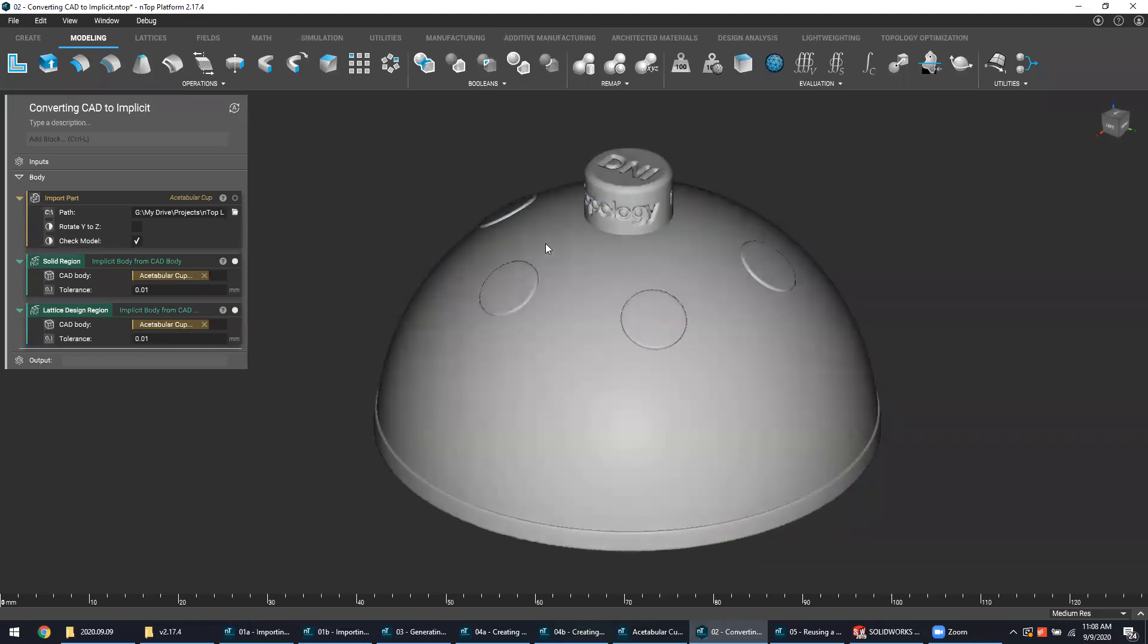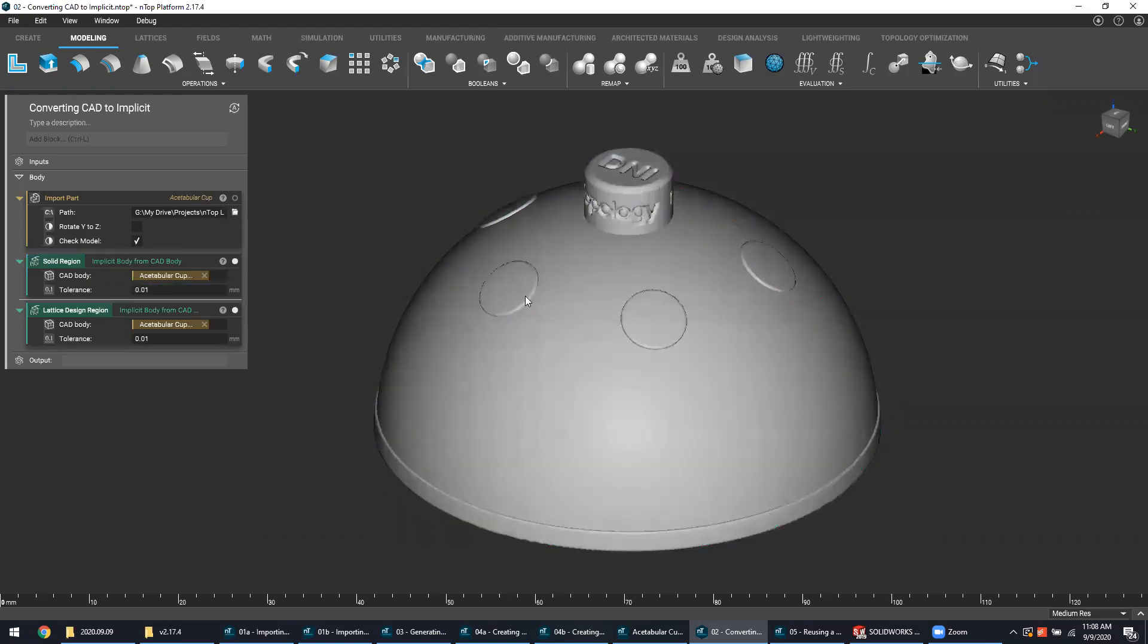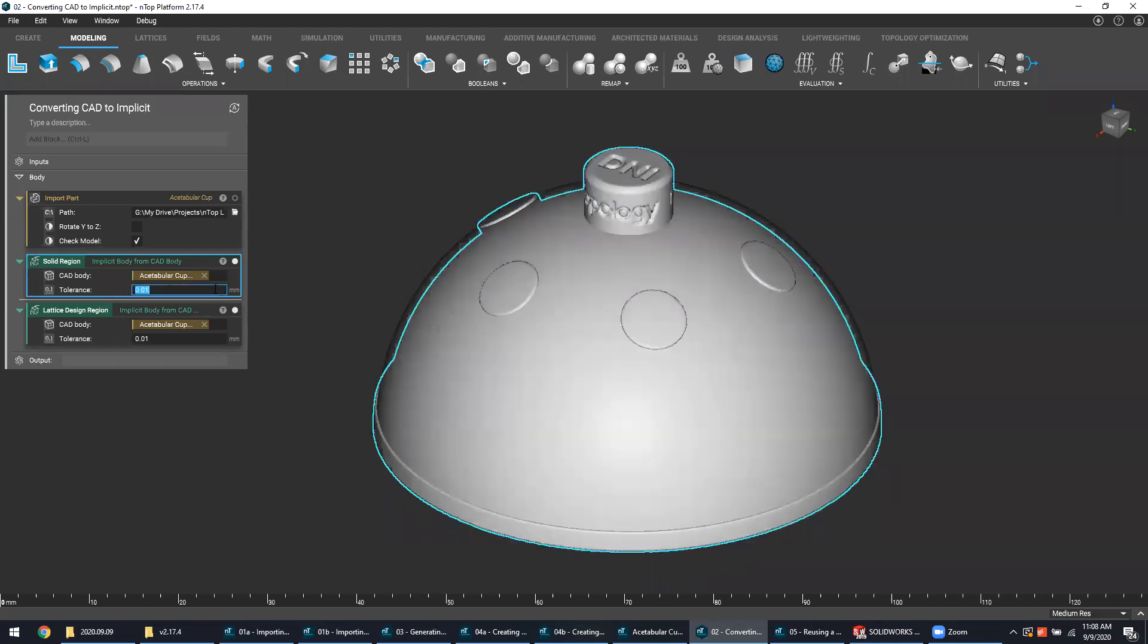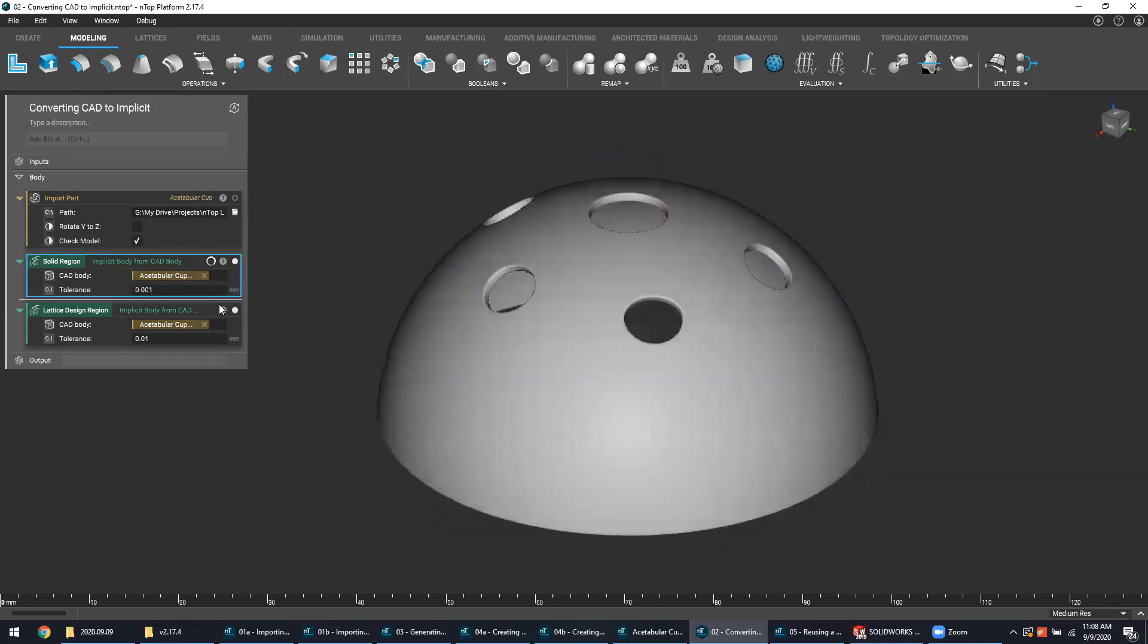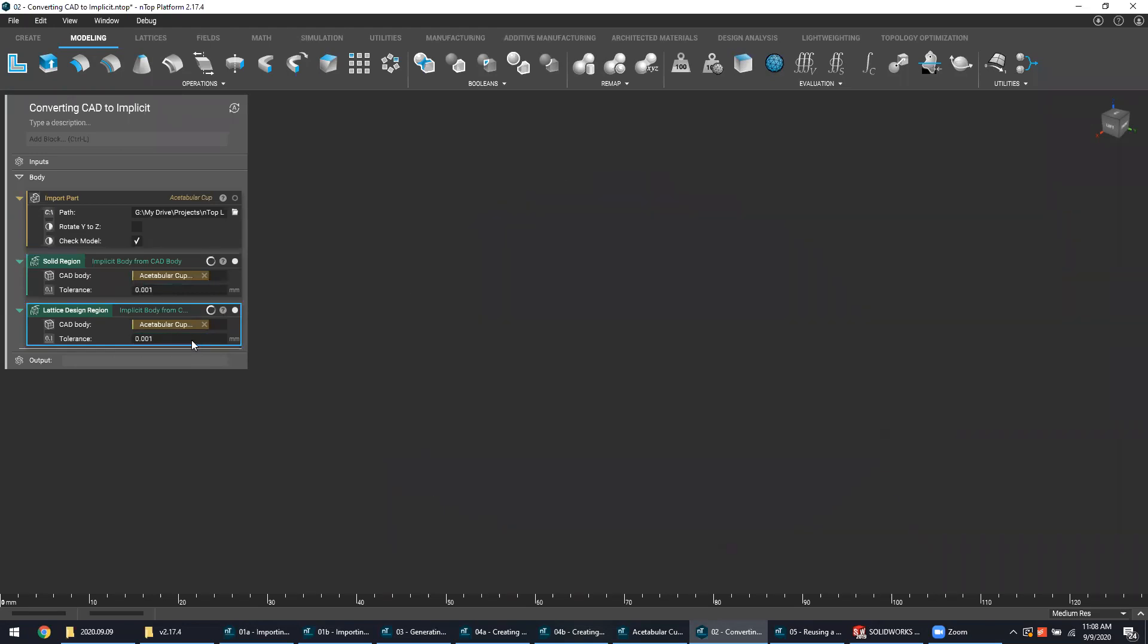As another note, because the acetabular cup is circular in nature, you may find that the default tolerance level for this kind of conversion might be too low at 0.01. So what I like to do is typically bump this number down to 0.001 for each of these, so that it can more accurately capture the curvature of the geometry itself.